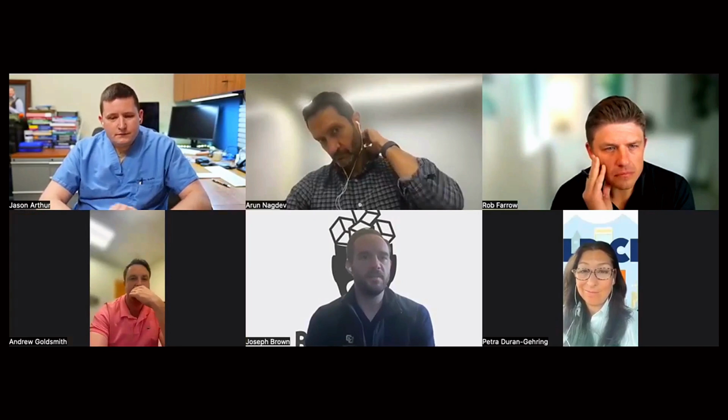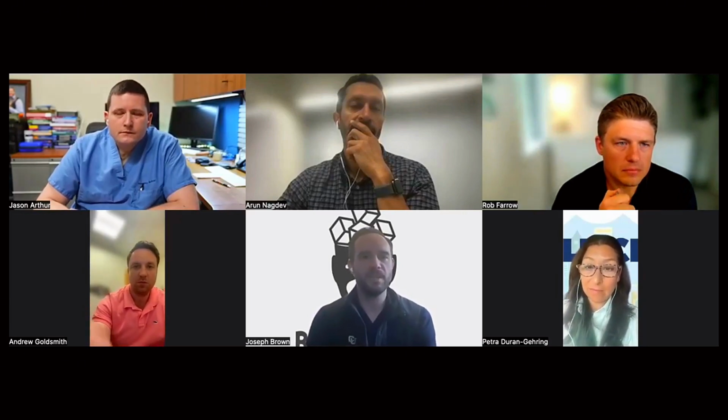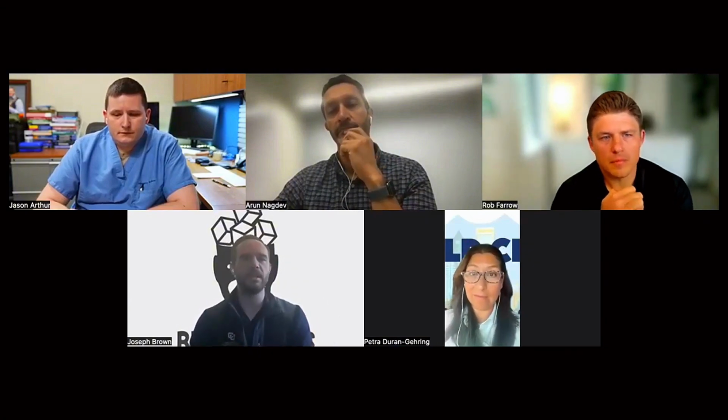I think it's a great question. When we've written some of our procedural guide, like the paper that Andrew and Arun and I put out a couple of years ago, based on other procedures, we had started with 20 as our spot. But I think it doesn't need to be a particular block because in the end, the skill set is the same across all the different blocks. I think we're still trying to figure that out exactly, but somewhere in that 20 to 30 range is where I notice with our residents that they seem the most confident and adept with keeping a needle in plane, and they're able to point at a target on the screen and get a needle there.